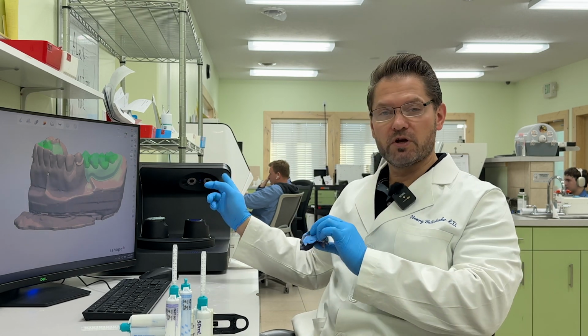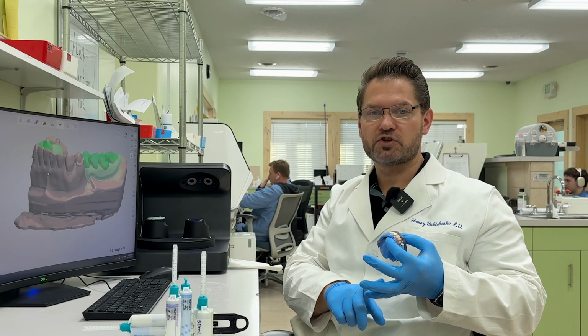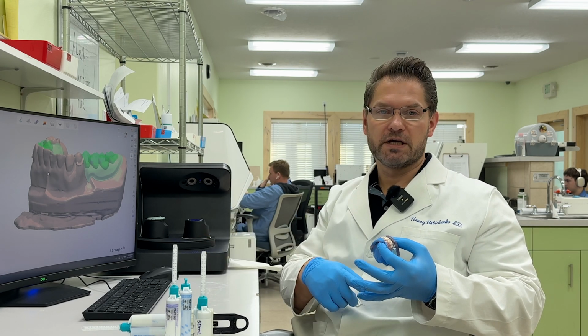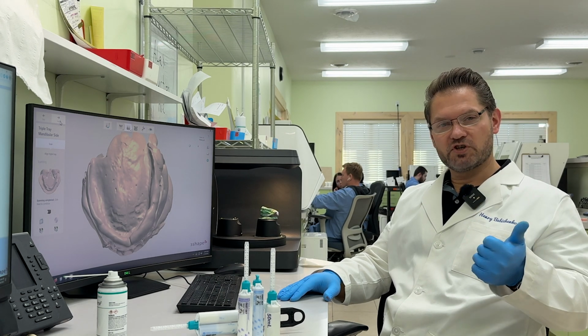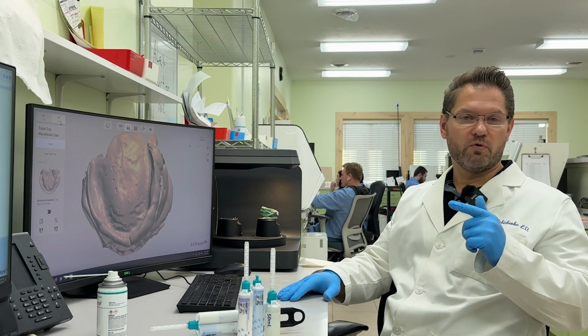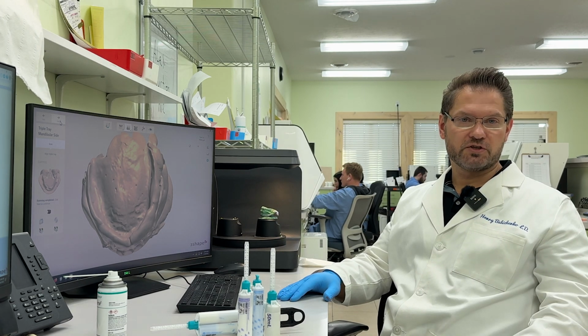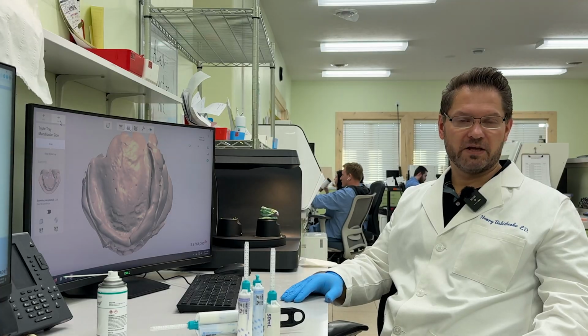Next step, when we scan, we're going to design, and we either can go ahead, process and finish, or we can do a try-in. And it's going to save you some chairside time. You can skip 2, or at least 1 appointment, actually, at the chairside, with a much happier patient.